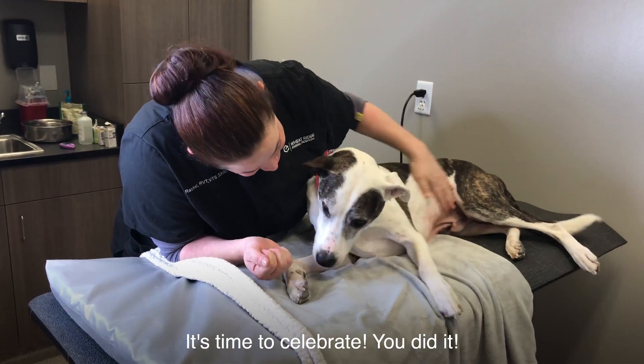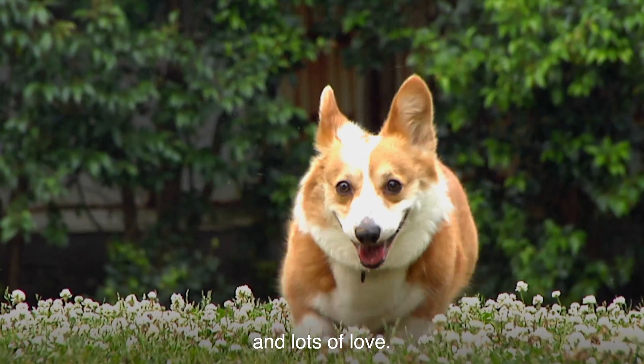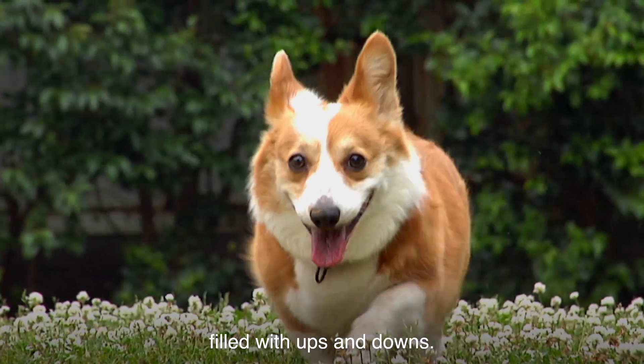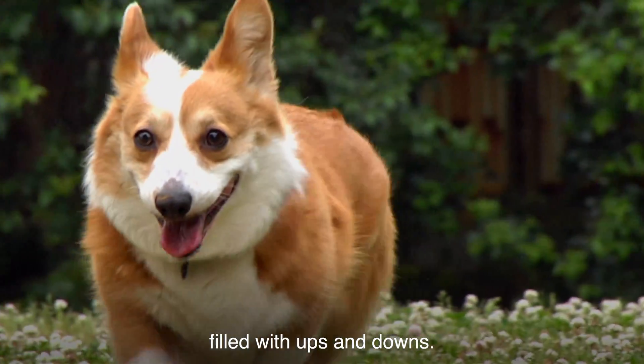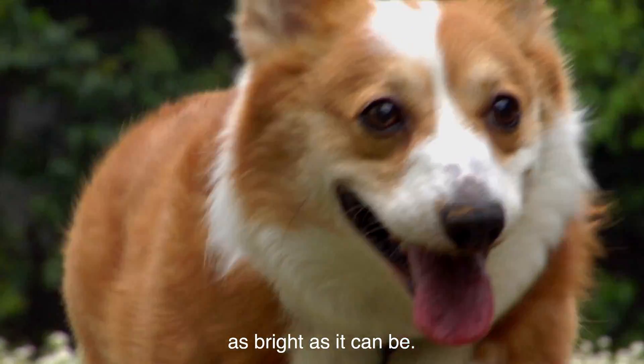It's time to celebrate — you did it! Give your pet a low carbohydrate treat and lots of love. Diabetes management is a journey filled with ups and downs, and your veterinary team will be beside you to make your pet's future as bright as it can be.